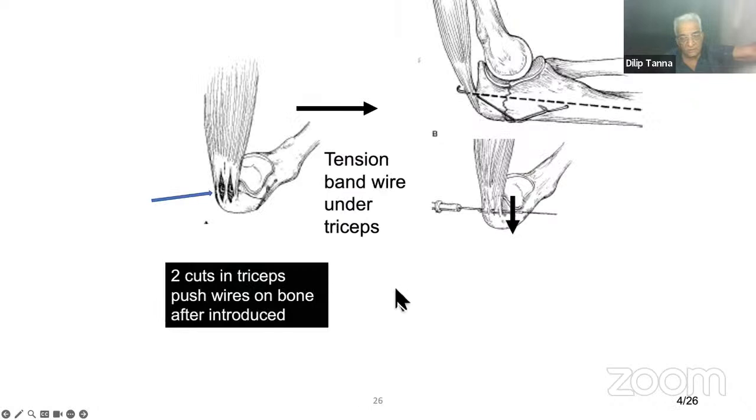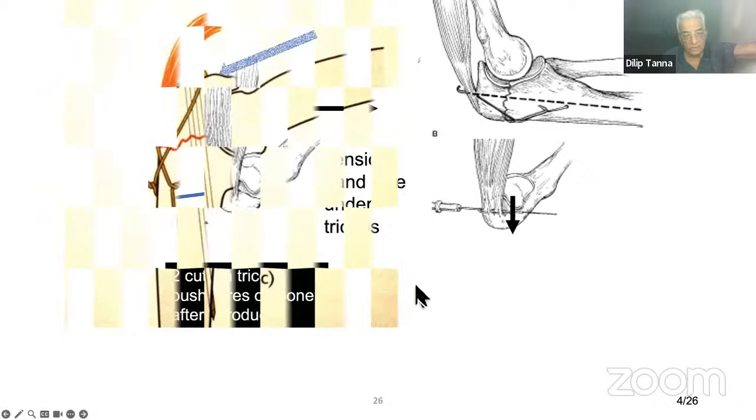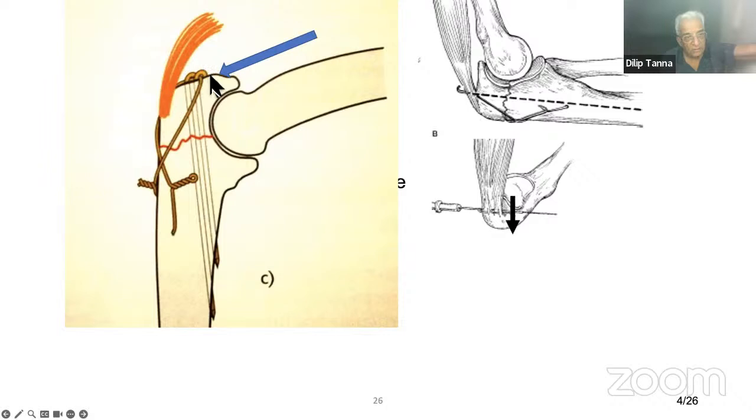Make 2 cuts here. Put the K wires, pass the K wires, and push them inside afterwards. 2 cuts in the triceps, push the wire into the bone and introduce it. And now put in the cerclage wire either through the wire there, or even you can put the cerclage wire here. There is no problem for that. And you see 2 knots is supposed to be better than 1 knot. And these wires have to come out anteriorly.